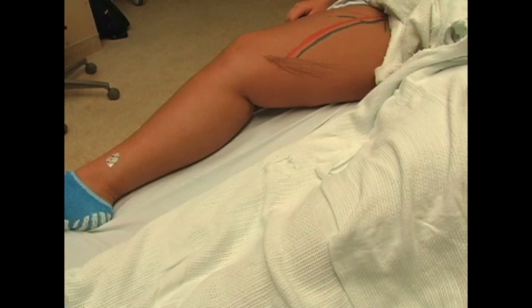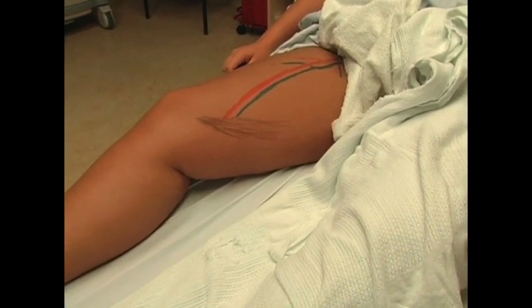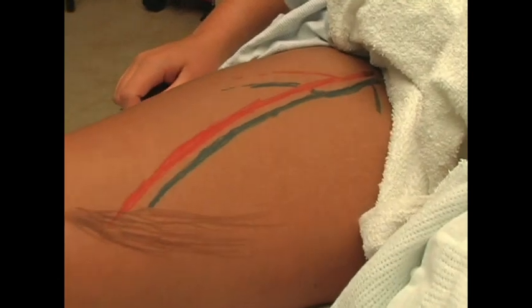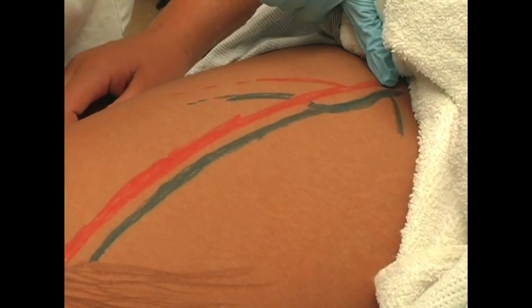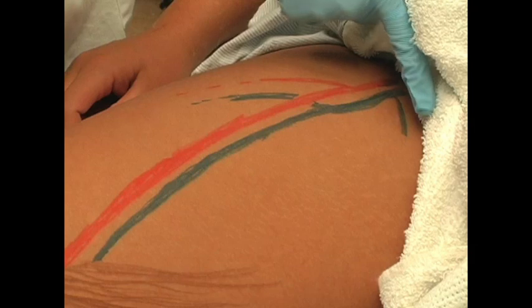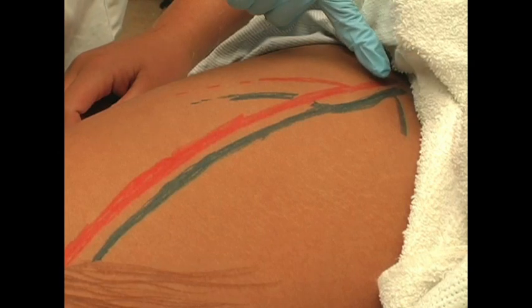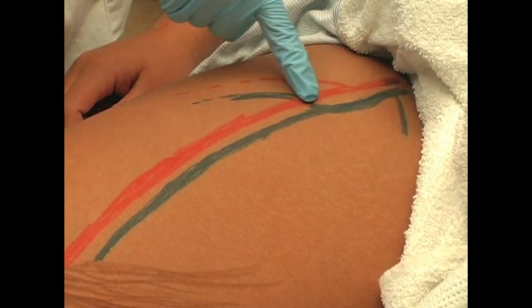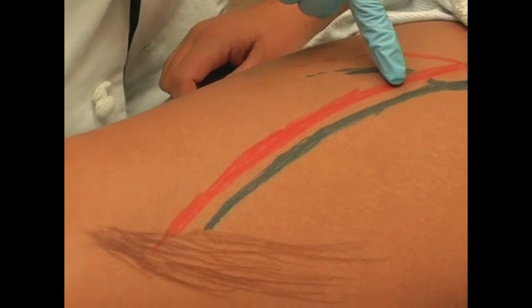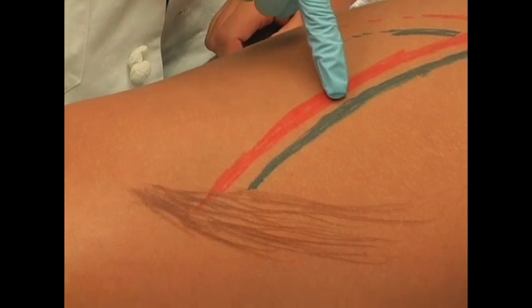While there are many venous structures in the leg, national guidelines direct imaging for DVT to the main deep venous structures of the proximal leg. Beginning at the inguinal ligament, the common femoral vein runs distally adjacent to the femoral artery. The saphenous vein is seen as a contributory vessel from the medial proximal region. The common femoral vein quickly bifurcates into the deep and superficial femoral veins. The superficial femoral vein runs distally in the medial aspect of the thigh and is easily seen by ultrasound.